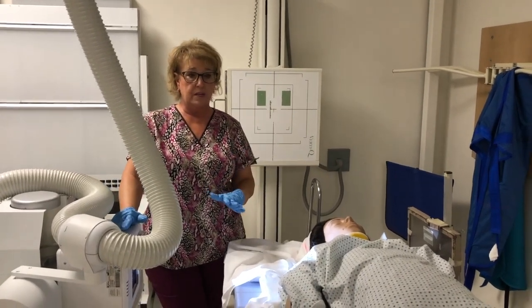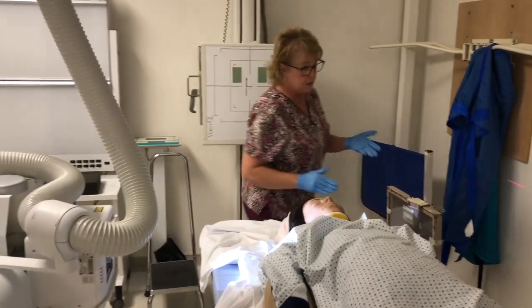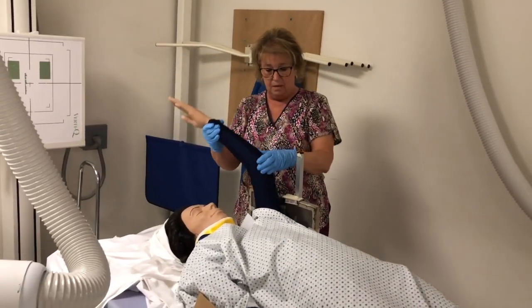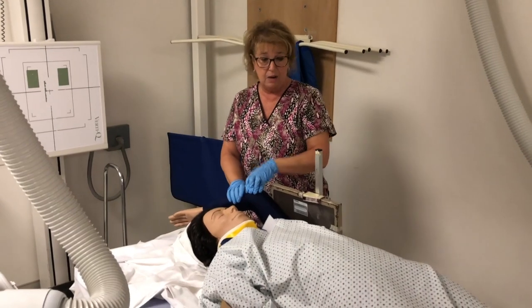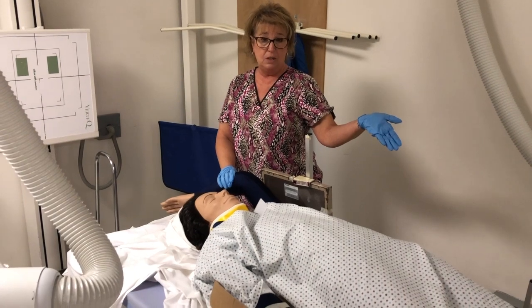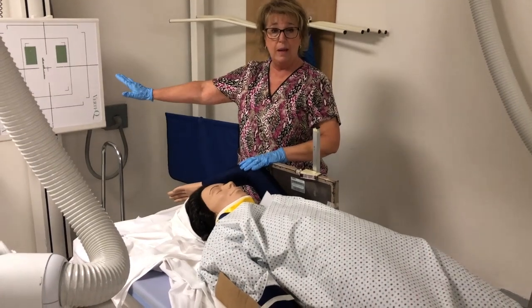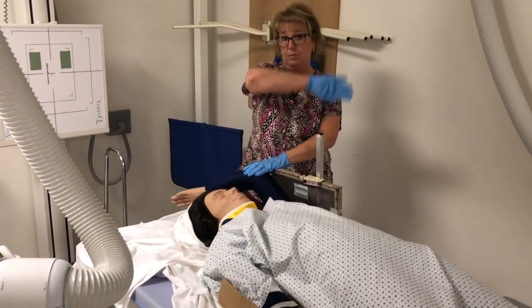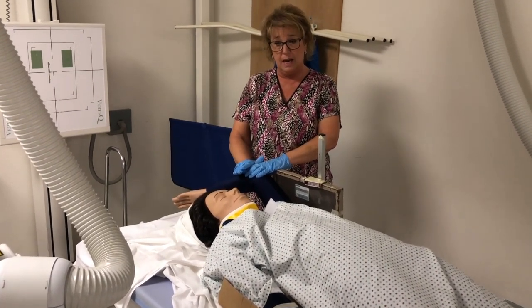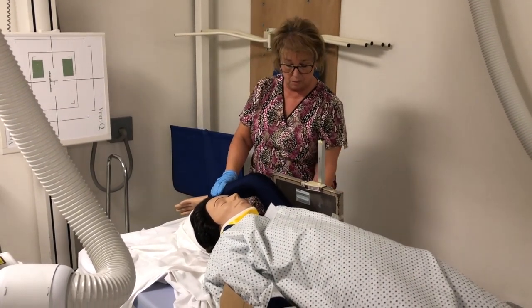hopefully depress the shoulders enough so that a swimmer's view does not have to be done. But if it didn't work, we could do a swimmer's view cross table by elevating the unaffected side. So in the scenario where perhaps it was her left arm that was injured, then I would probably wait to do the swimmer's view until I got her back on the gurney, and then maybe put her up against a wall bucky, or from the gurney I would bring the tube to the other side, because you still want to elevate the arm that's closest to the IR. And in this setup, this is the uninjured arm, so this works well.